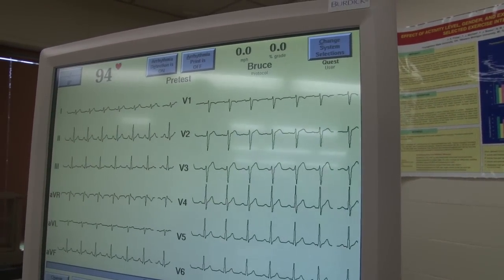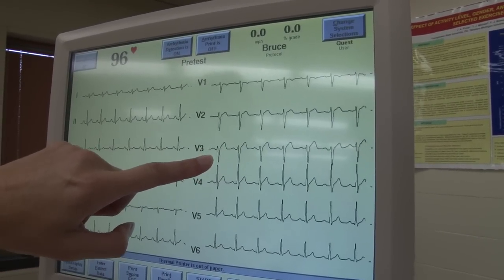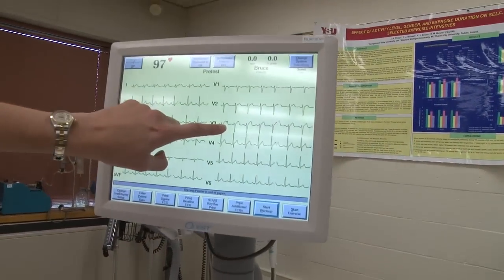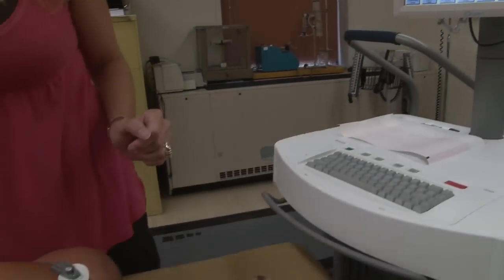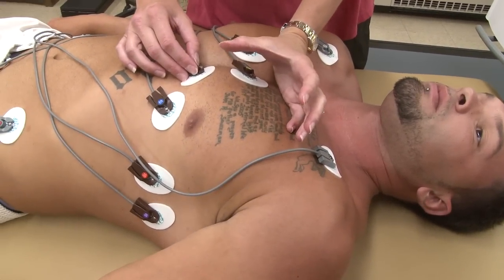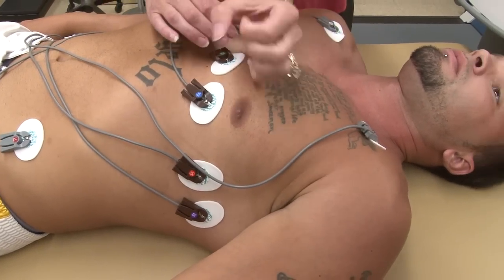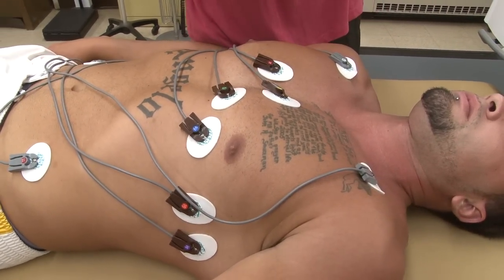below the baseline. Now on Jake with V3, and it could be our placement of our electrode, but you see that it is mostly down as well. And a lot of clients, what you'll see is that this one is biphasic, meaning it's equally above and below the baseline, just as much above the baseline as below the baseline. It's not the case with Jake, but that happens sometimes and other times it doesn't. So just remember that a positive wave going towards a positive electrode is going to create a positive deflection on the screen. A positive wave going away from a positive electrode will create a downward or a negative deflection.